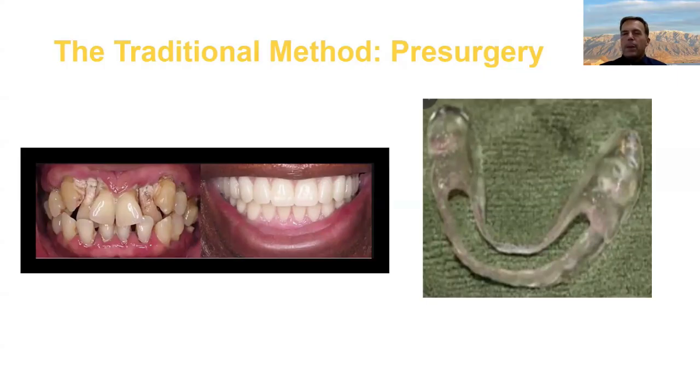Of course, for a freehand conversion, you'll need an immediate denture, so you need to take records with nice borders for your laboratory. Take a bite where you want the person to be. Your laboratory will cut the teeth off the model, set denture teeth or design them, process or print a base, and send you an immediate denture. A lot of times the laboratory can also duplicate that denture in clear and cut a slot behind the incisal edges of the anterior teeth as a guide to the surgeon. If you can get implants in this zone, we can get a nice result for this patient.